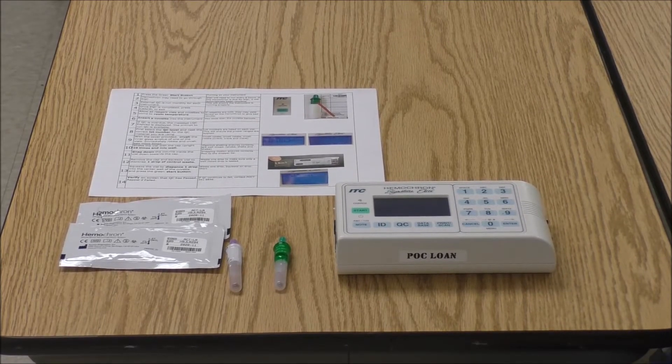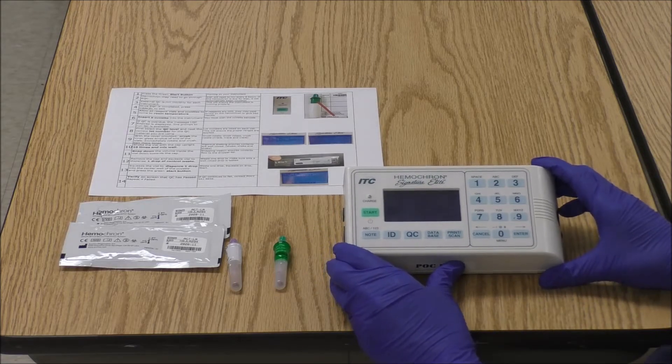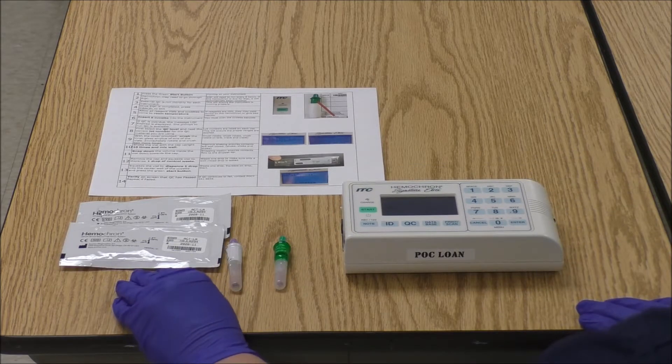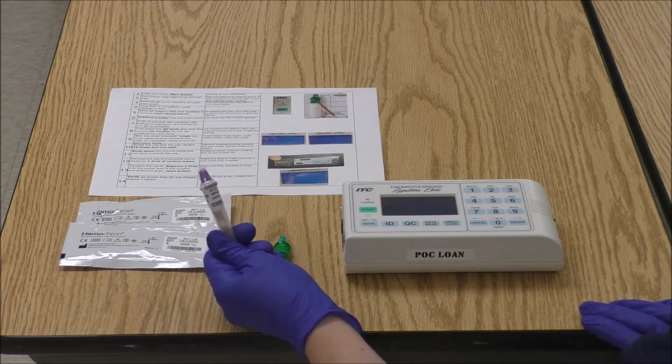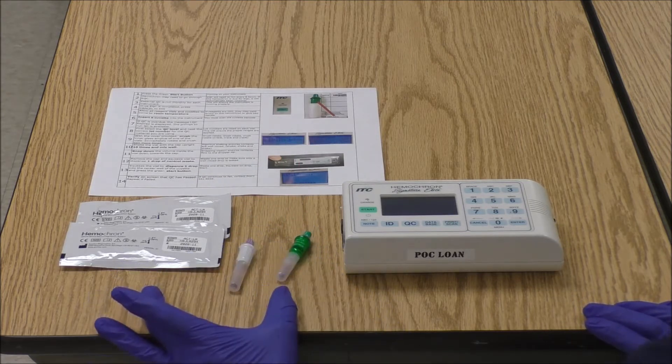Running liquid QC on the Hemocron Signature Elite. You need your instrumentation — the Hemocron Signature Elite — your Hemocron cuvettes, and your liquid QC for normal and your liquid QC for abnormal. These supplies, your cuvettes and your liquid QC, should be at room temperature before you try to run QC.